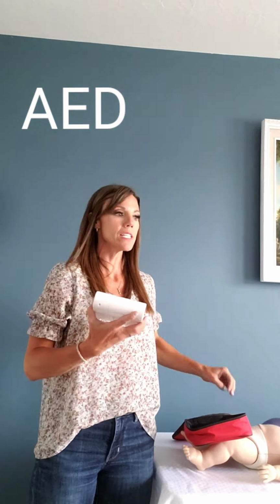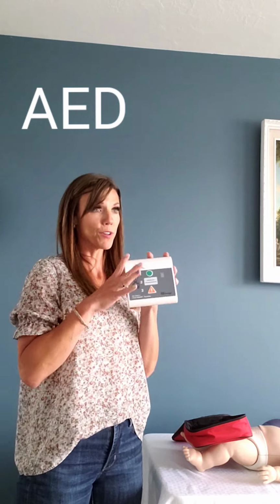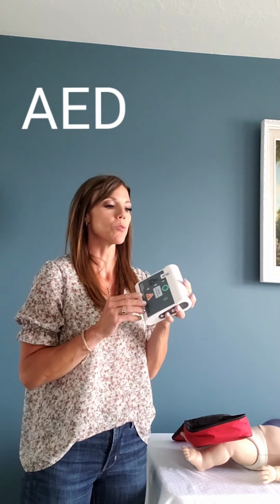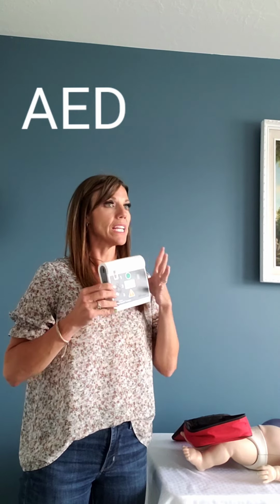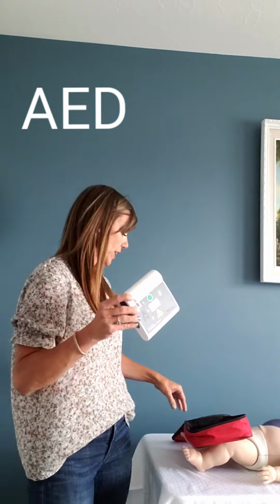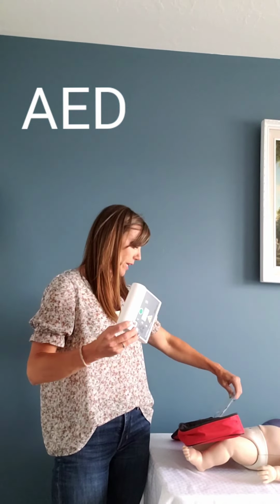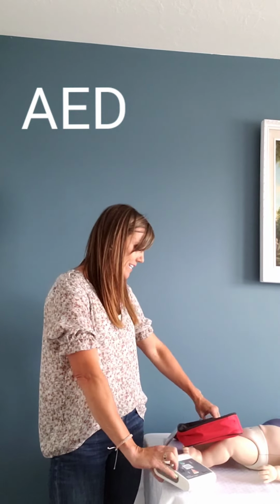Okay, so we are going to talk about AEDs right now. AEDs are awesome. So first off, know an AED is also called a defibrillator. So if you ever hear someone say like we need to defibrillate them, an AED is a defibrillator. It's an external defibrillator. So an automatic external defibrillator, that's what AED stands for.